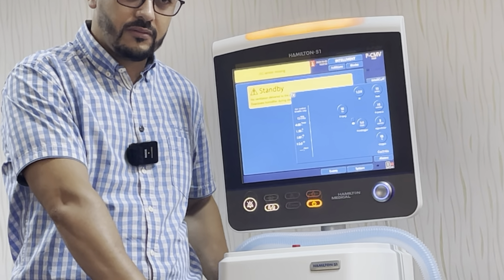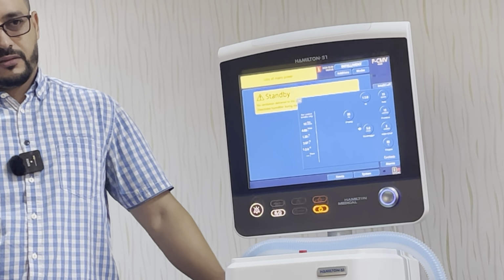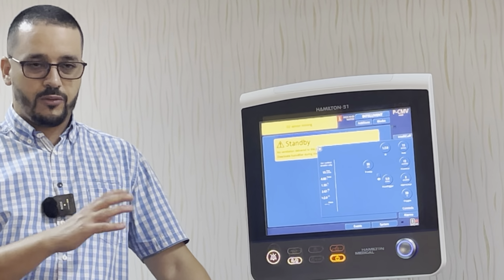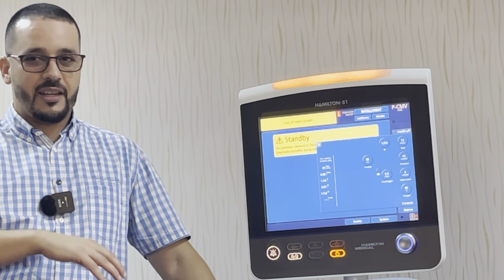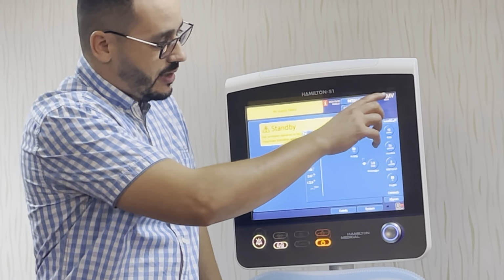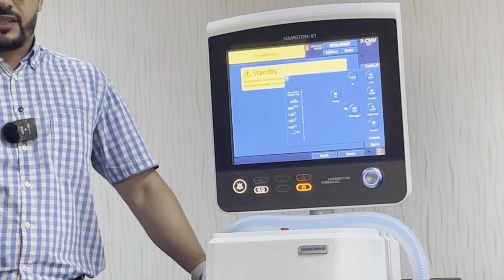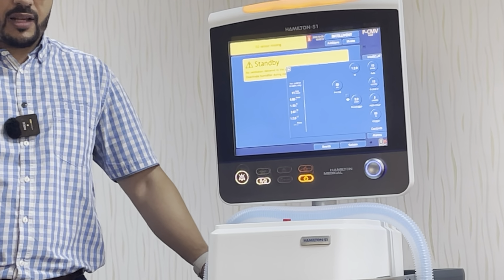But controlled mechanical ventilation should be used when the patient is paralyzed and not taking spontaneous breathing. Now, after explaining the difference between both of them, maybe at the end I will re-ask the same question. So the first mode, as I said, CMV and pressure CMV, both modes are mandatory ventilation, designed for a passive patient. These modes were created maybe in 1980.